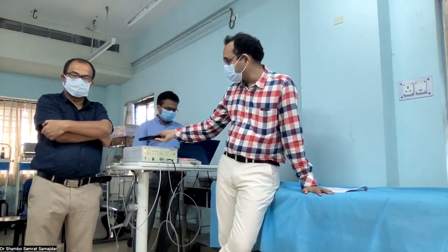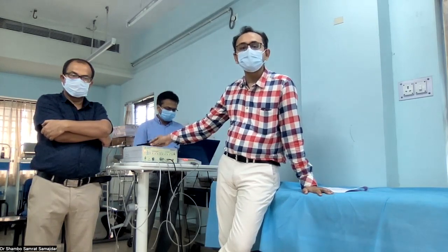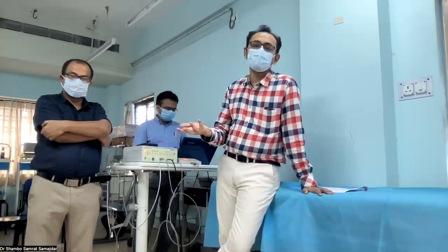Then we need to check the blood pressure again. Here we need to understand the diastolic blood pressure value. If the diastolic blood pressure value is more than 16 millimeter of mercury than the baseline, then we can call it a normal hand dynamometer testing or normal diastolic blood pressure rise. So this is the basic thing which we can do in our clinic physically.